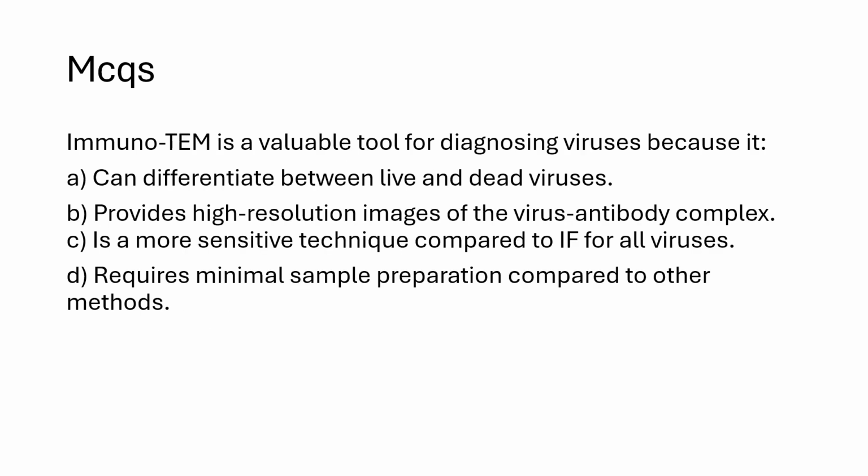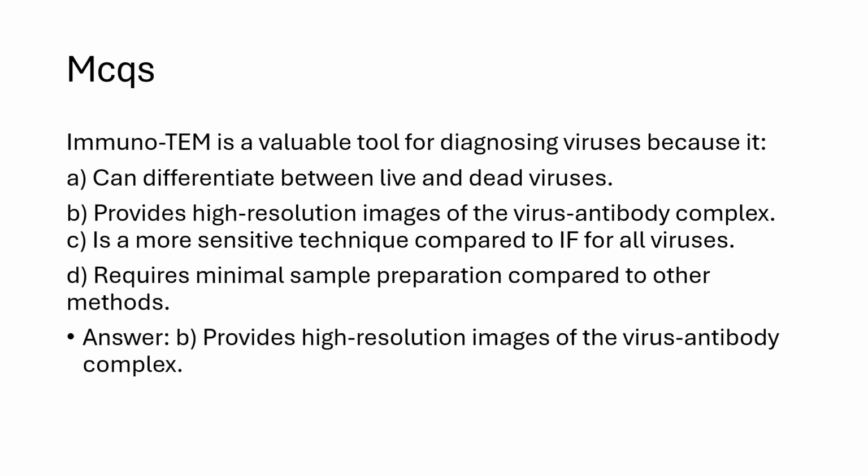Immuno-TEM is a valuable tool for diagnosing viruses because A. It can differentiate between live and dead viruses. B. Provides high-resolution images of virus-antibody complex. C. Is a more sensitive technique compared to immunofluorescence for all viruses. D. Requires minimal sample preparation compared to other methods. Answer is B. Provides high-resolution images of virus-antibody complex.